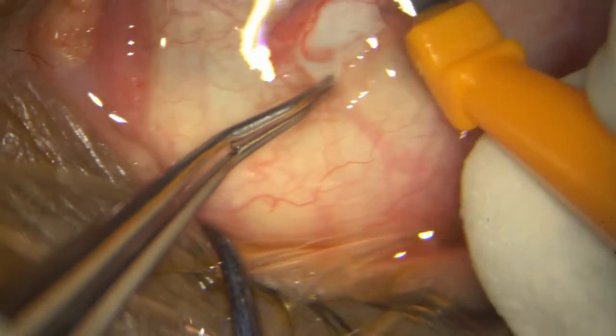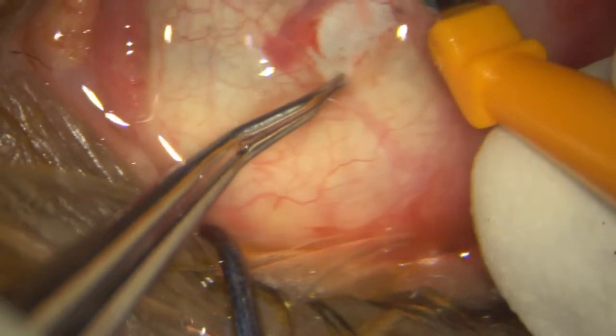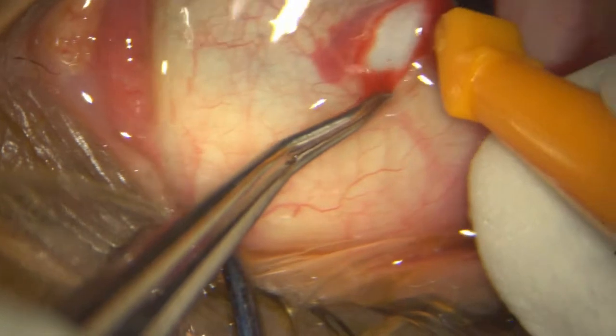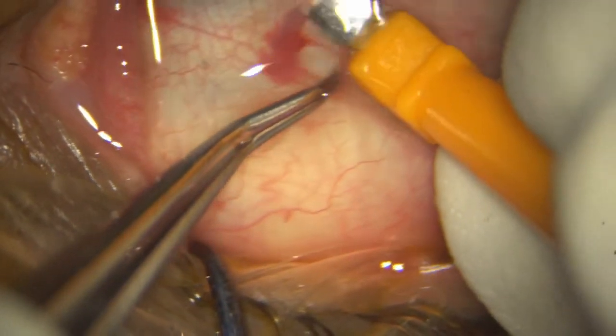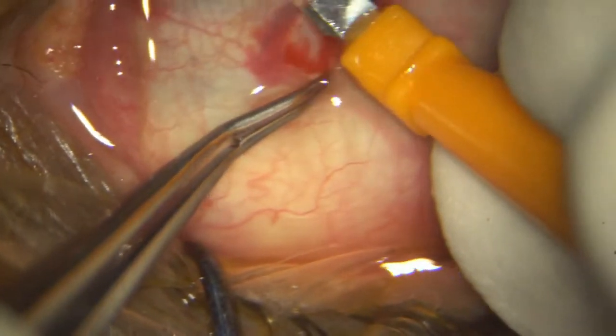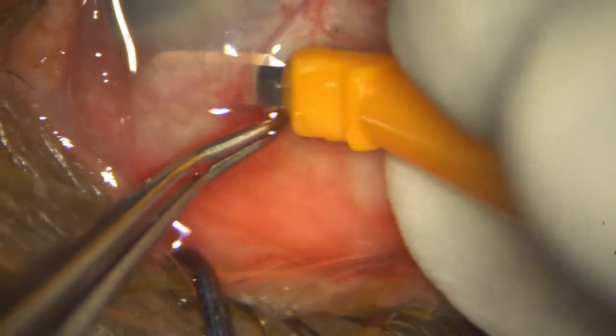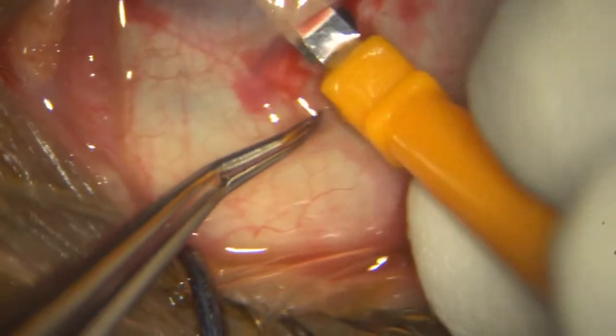I am very sorry that is out of the field, but this frequently happens with these patients who move their head down. Since I don't want to remove my crescent blade and readjust her head or the microscope, I just continue like this, but it doesn't make for a very good video. Here I just pulled it back.